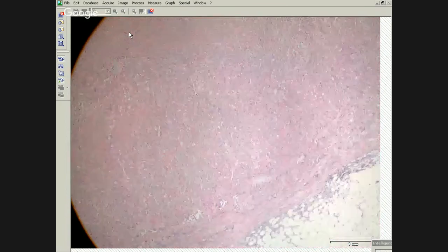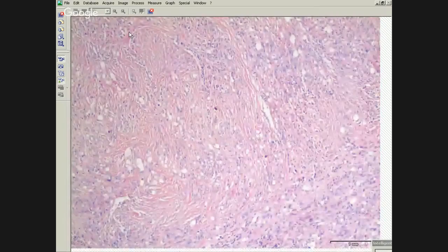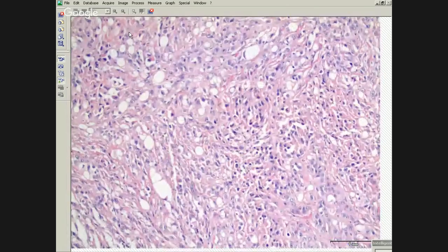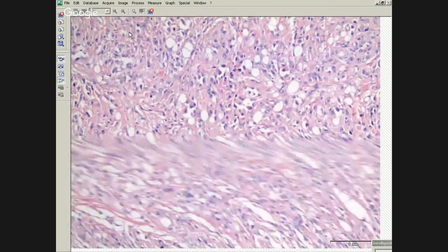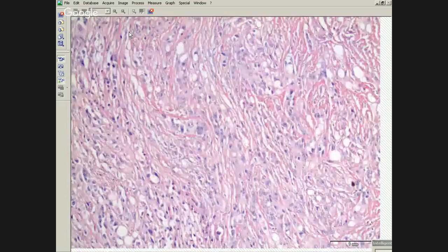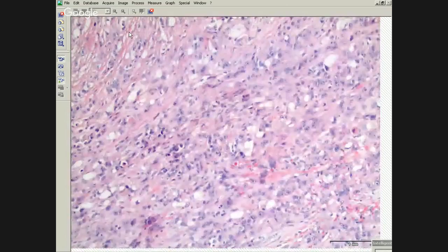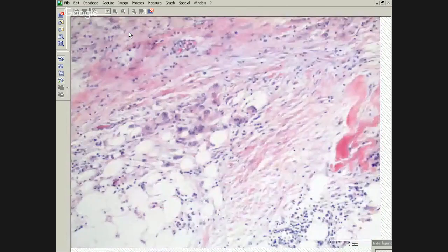But down here we've got something else. There's some signet appearance, small signet ring areas. The cells are in close proximity. Looks bland, but this can be a vascular tumor like a hemangioendothelioma, epithelioid hemangioendothelioma, something like that. Okay. All right. See, now you're thinking because we showed you the case before.